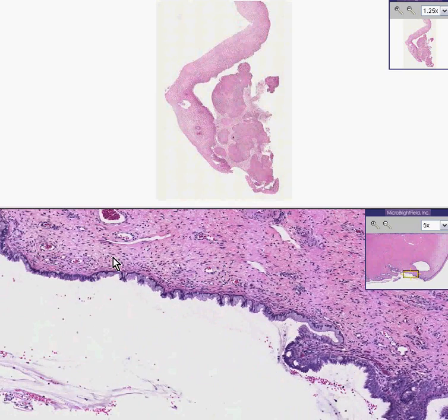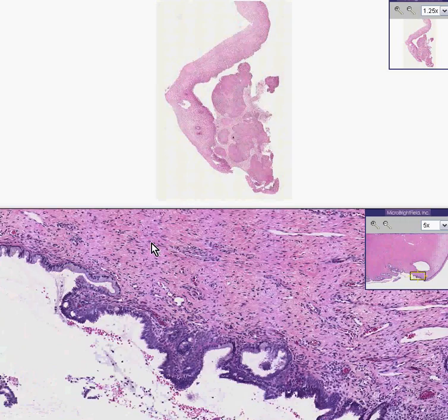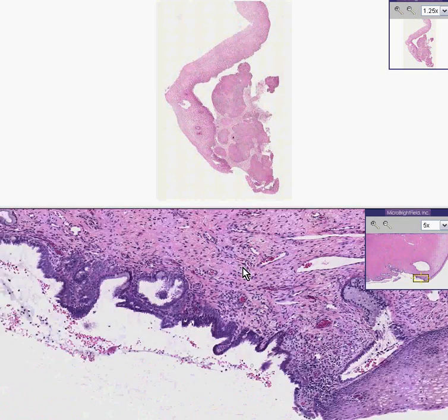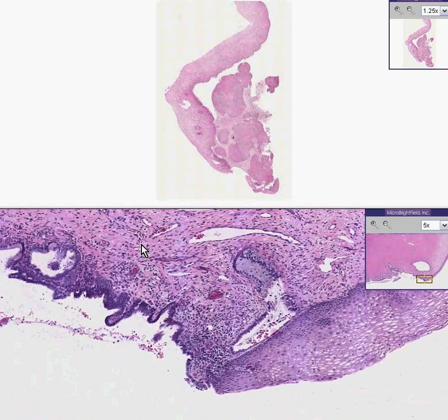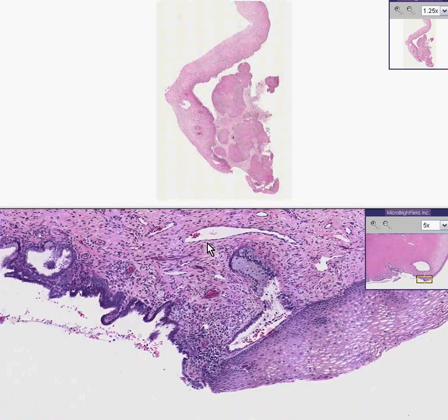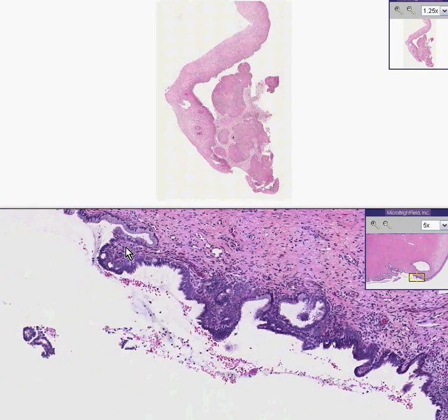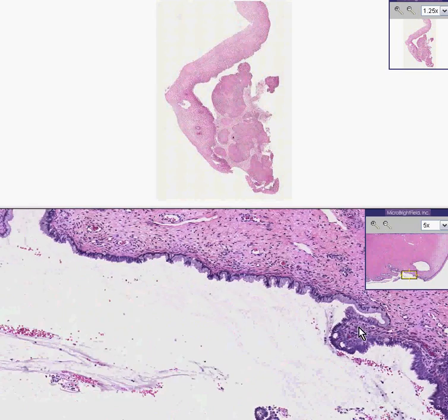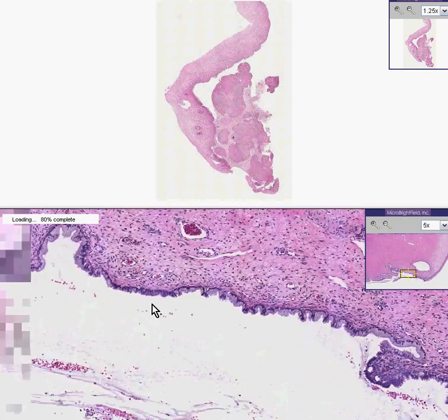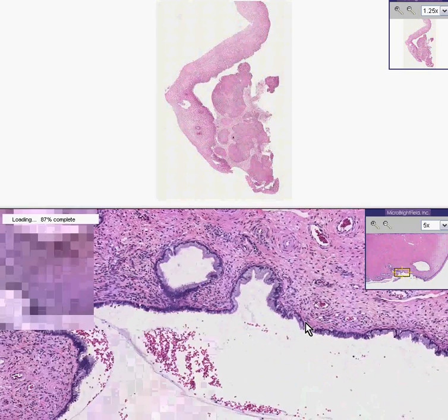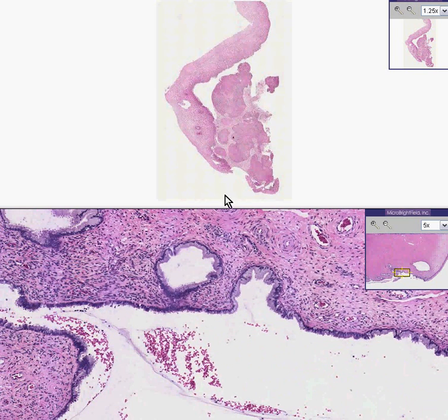Notice how these columnar cells are nice. There seems to be a nice line of demarcation from the squamous side to the columnar side. And when you go along the columnar side, you don't see little nests of squamous metaplasia either.